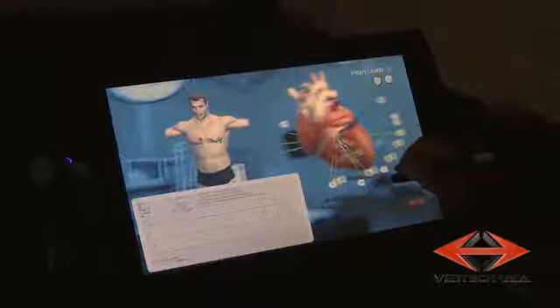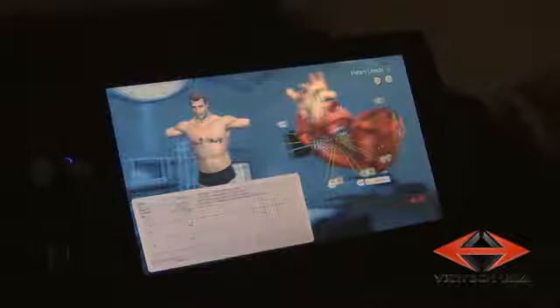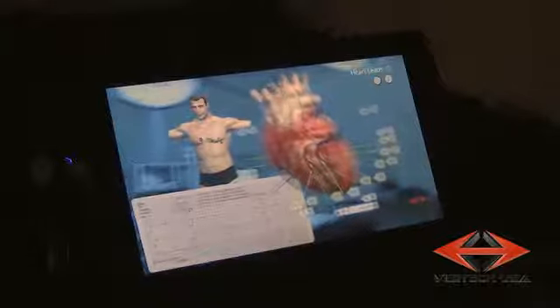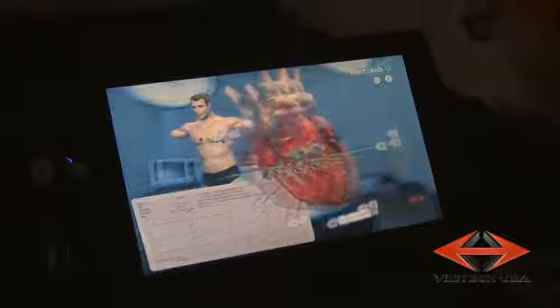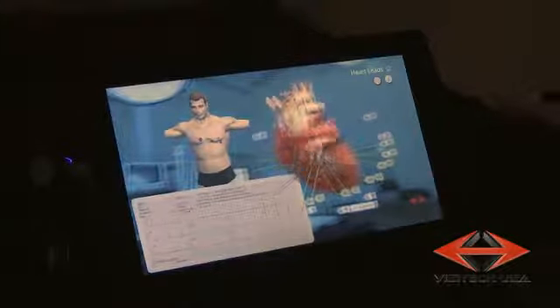Whenever we look at these readouts, we can see that V1 is portrayed there, and it highlights V1 vector going through the heart. Now, if we pull the front of the heart away, we can see that V1 electrode is going through the center of the heart, and it's measuring what's called the septum, or the septal wall. V2 is in a similar region. Look at AVR, AVF. Each one of them are highlighted to show you what region of the heart is being measured. Now, you can bring this heart a little further out, and by leaning into the display itself, you're able to see a clipping plane that looks at the interior structure of the heart where each one of these exists.